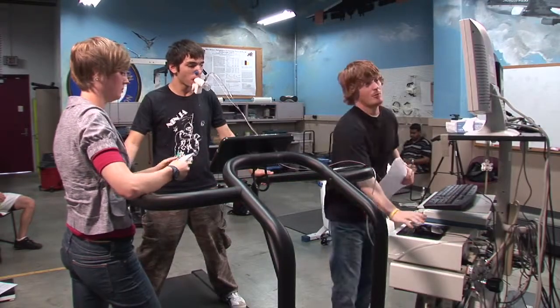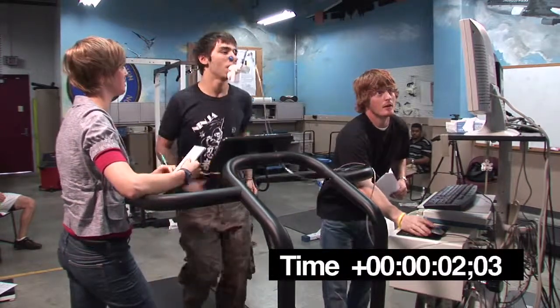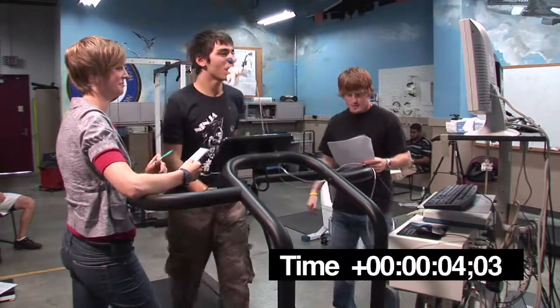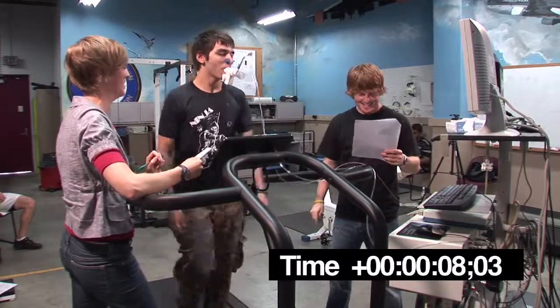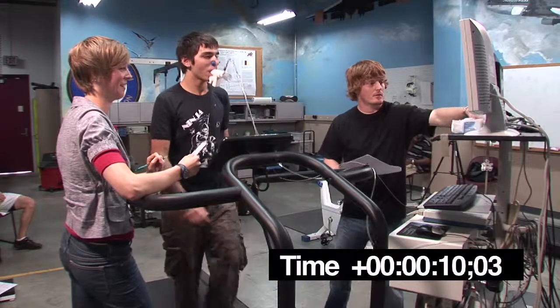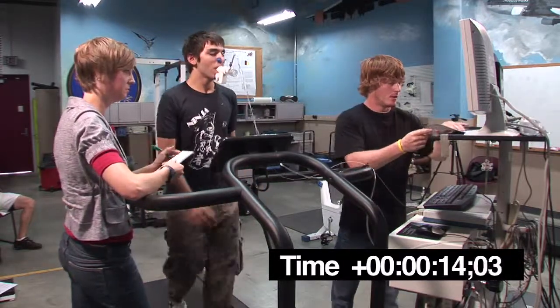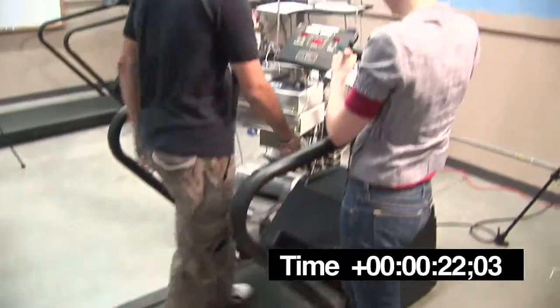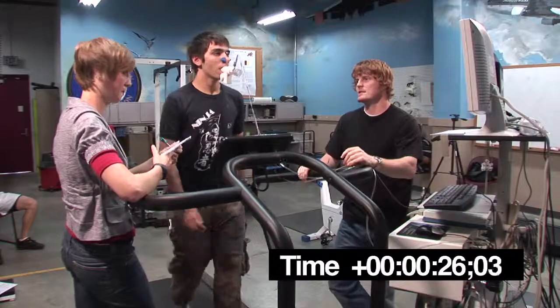Okay, test starts as soon as you hop on the treadmill. You just want to kind of double check the time, Daniel, for three minutes in case I can put these off.